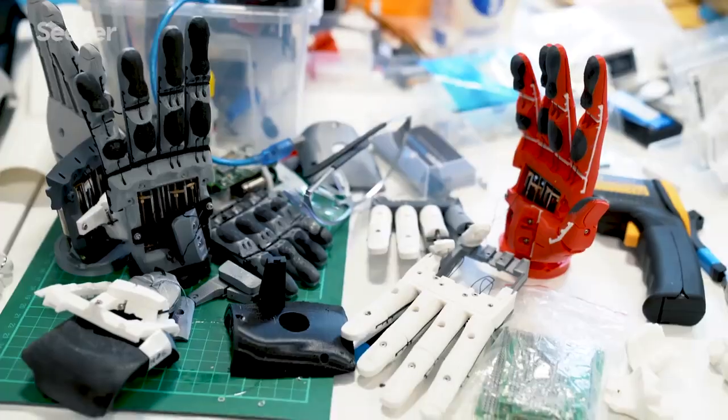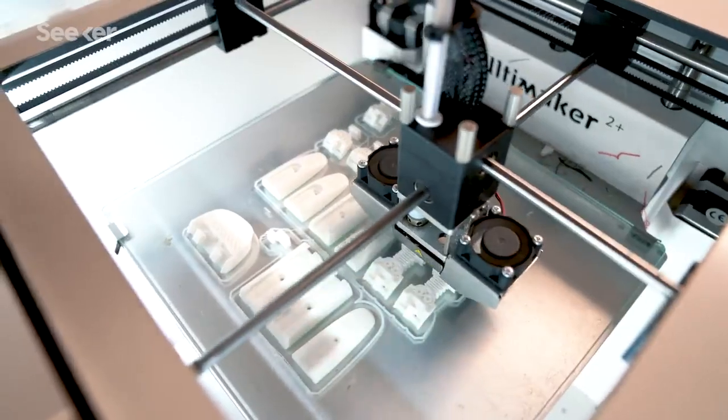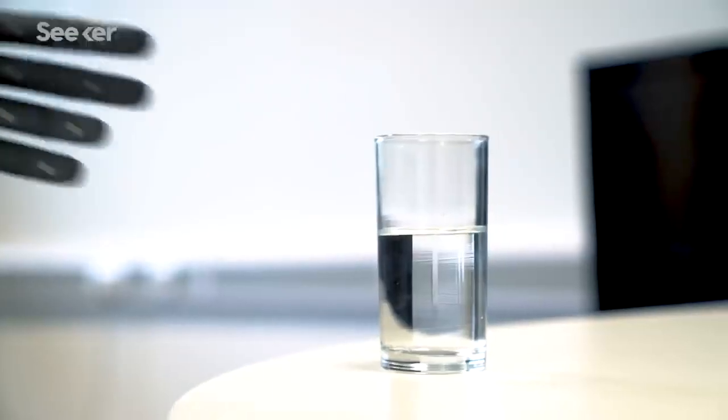The Hero Arm is our first bionic product. It's the first medically certified 3D printed bionic hand, and it's also the most affordable bionic hand available.